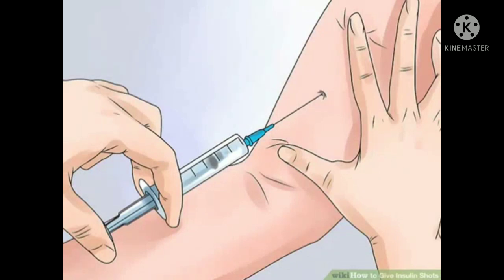Inject the insulin. Once you've chosen the site, it's time to inject. The site should be clean and dry — wash it with soap and water if it's unclear. Pinch your skin and fat together and gently pull it away from underlying muscle, then insert the needle at a 90-degree angle. If you're lean, as is common with type 1 diabetics, insert the needle at a 45-degree angle for more comfort. Insert the needle all the way in, let go of the skin, and inject the insulin slowly and steadily by pushing the plunger until it's all gone from the syringe.